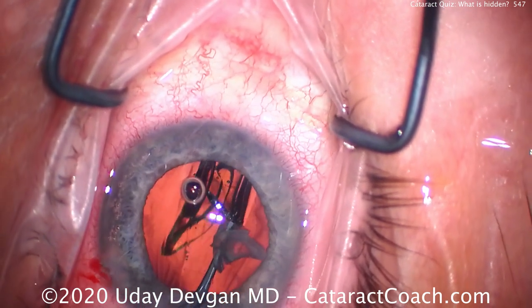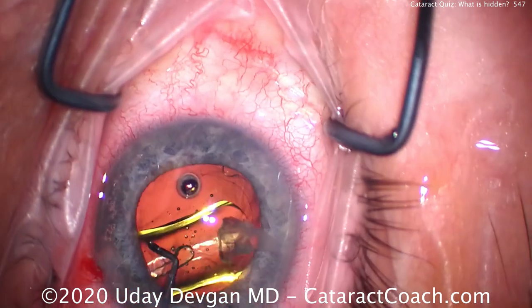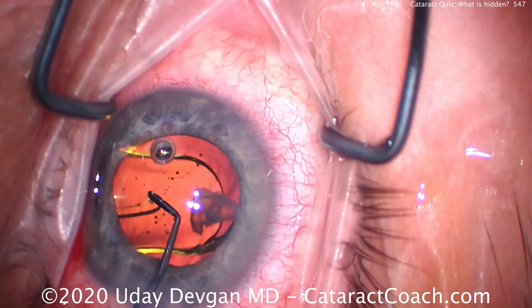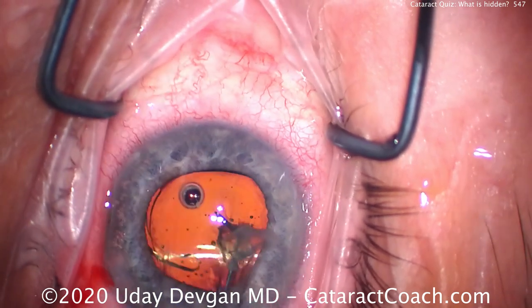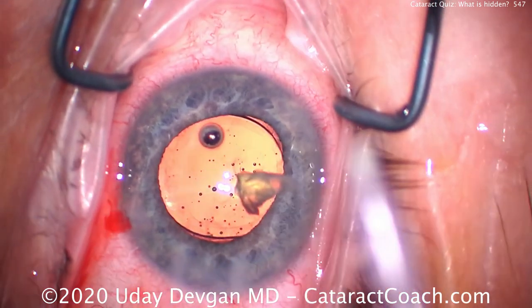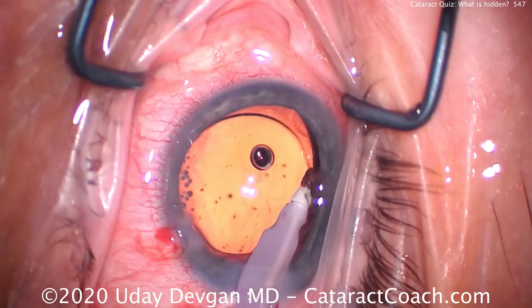Here comes our single-piece acrylic lens going into the capsular bag — we'll rotate that around and get the haptics in there. We still have that nuclear piece in the anterior chamber; we've pushed it towards the center with the cohesive viscoelastic. Once I get this lens unfolded, we can try to dial or push that piece of nucleus out of the main incision, or simply use the IA probe and aspirate it — either one is appropriate.